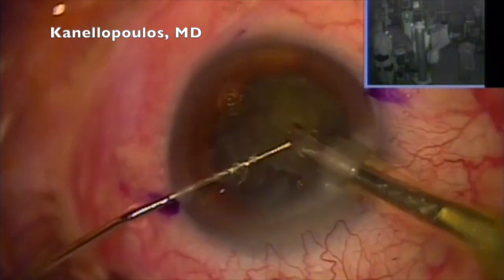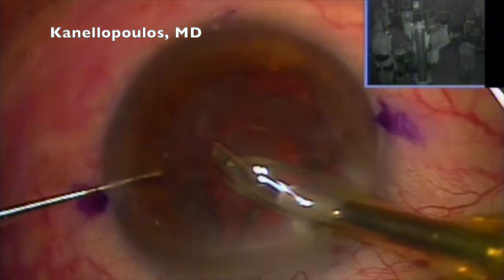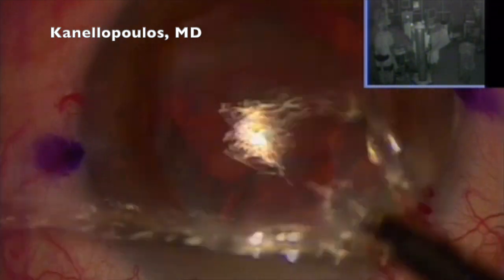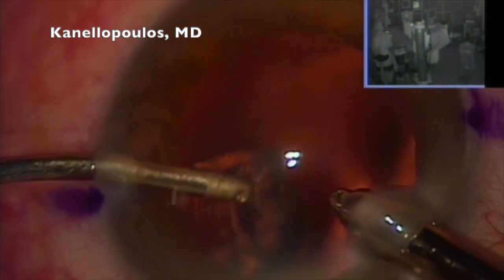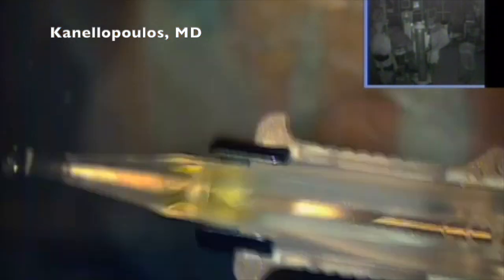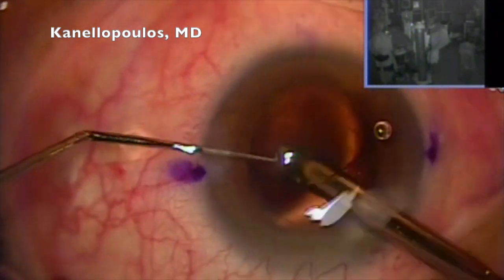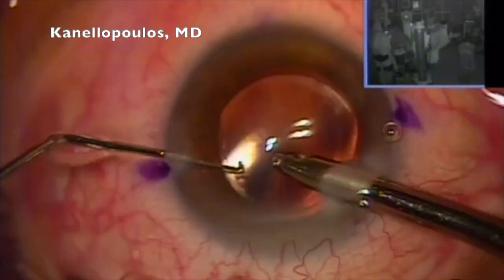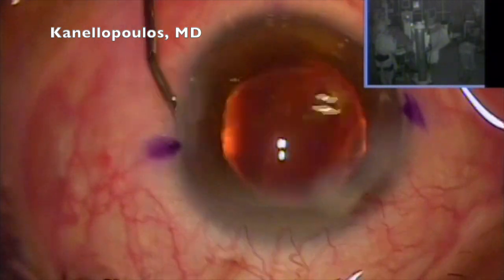Divide and conquer here — I'm at 60% energy. Nevertheless, I've used a total of 60 joules in this case, which I think makes the argument that this technology is really very competitive to anything that I've seen. After all, White Star with AMO — now J&J — was the first one who gave pulsed ultrasound and was able to reduce energy. We're seeing here the rolled lens in position. Our work with the nanosecond laser back in the late 90s showed finishing cases with four joules, and that pushed the phaco industry to reduce phaco energy — and hopefully we have healthier and better corneas.